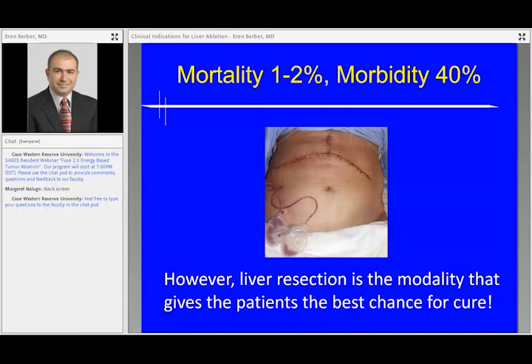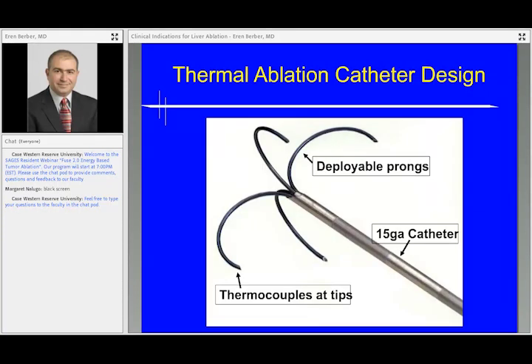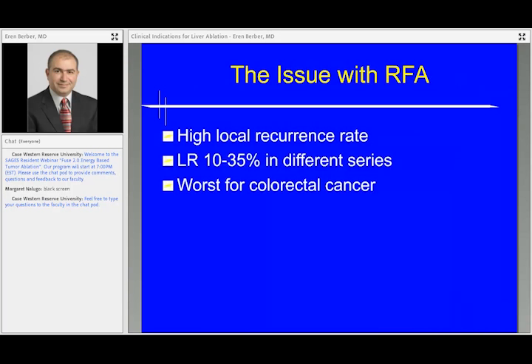And as I mentioned, despite the resection being the gold standard, even in the top center, there's 1 to 2% mortality and morbidity goes up to 40%. But we still have to acknowledge that resection is the modality that gives the patient the best chance of cure at this time. I'm not going to go into too much detail, but just maybe historically mention that our clinical experience has really blossomed with radiofrequency ablation.